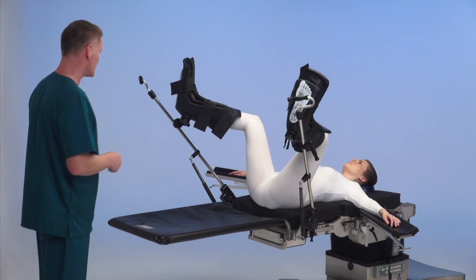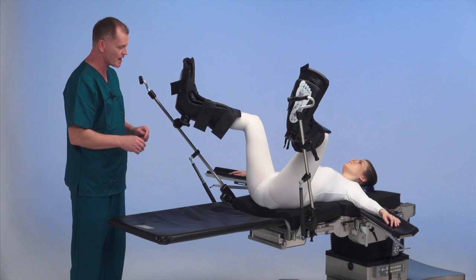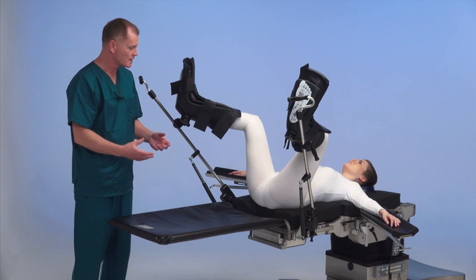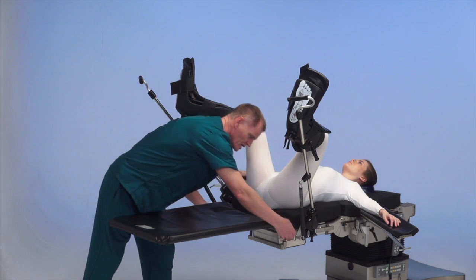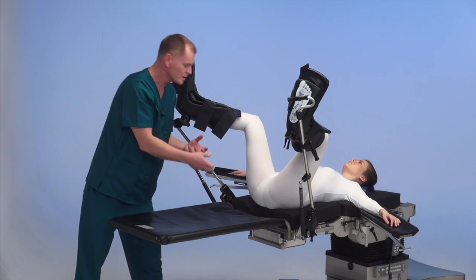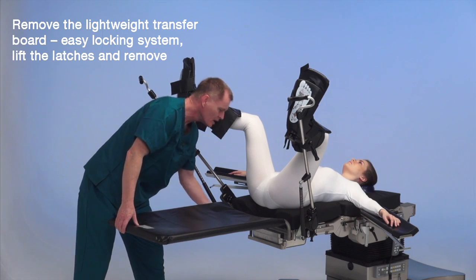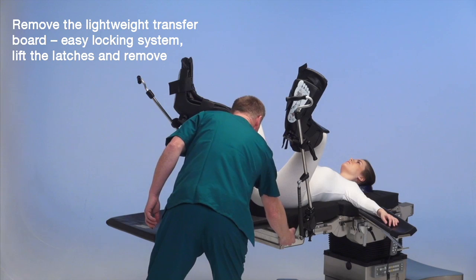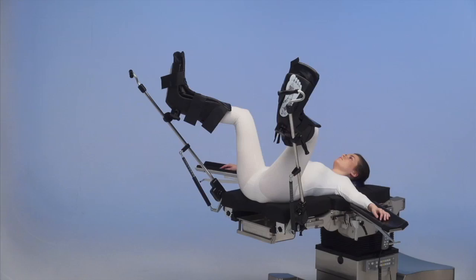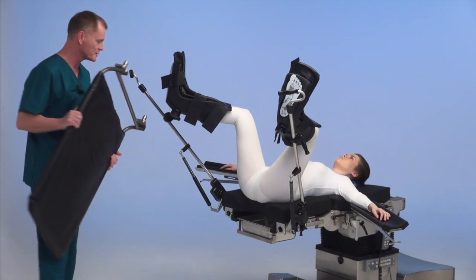The nice part of the transfer board: once we have the patient in lithotomy position, with other transfer boards from competitors you need to reach in, unscrew, squeeze, and hold to remove the transfer board. With this system, we simply lift the latches walking around the table and then remove from the end.